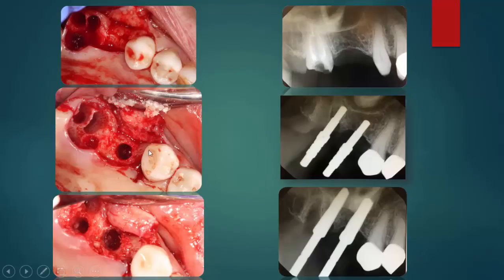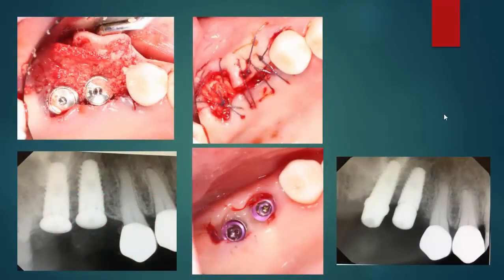مثل ما ملاحظين هلا هون احنا بالدنسابير لما نستخدمها بتعمل لي اوتو جرافتنج للساينس فلور، يعني هي بتدفش العظم نفسه apically into the sinus. وهون بالصورة هون بنشوف الcompacting للبون جرافت ضمن الاوستيوتومي. Then this is the X-ray. هون the implant placement.